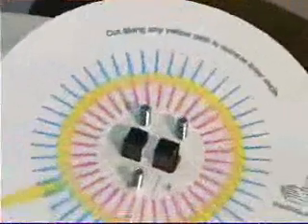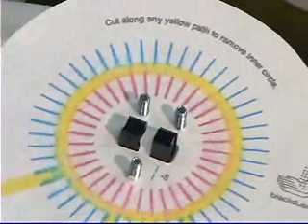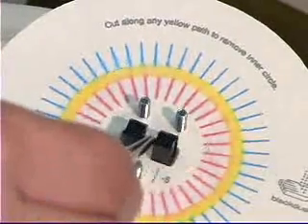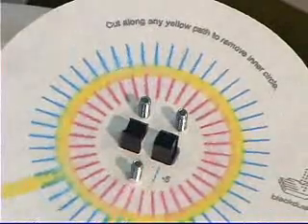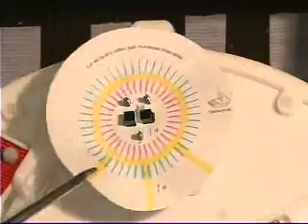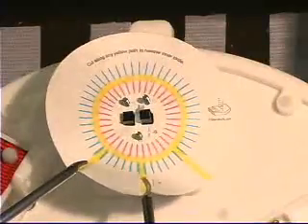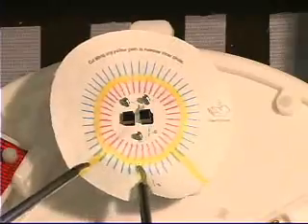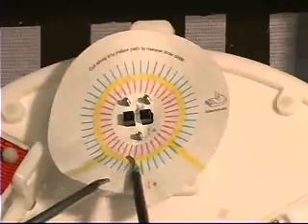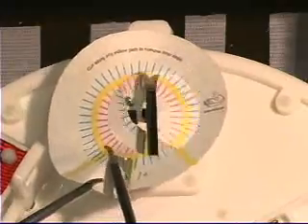The tabs must cover the inside area in the pod in order for the completion of the task to be sensed. The operator must cut through the yellow line and cut the circle as accurately as possible. The operator can choose to use instruments in either hand and can switch instruments as they see fit.